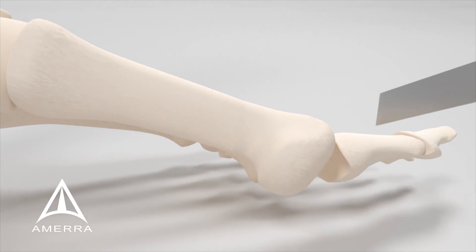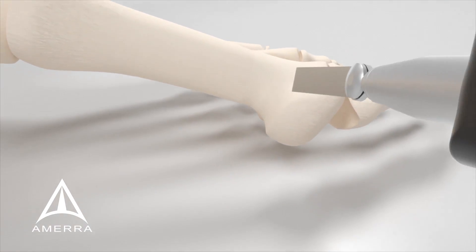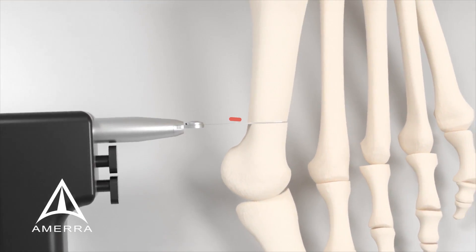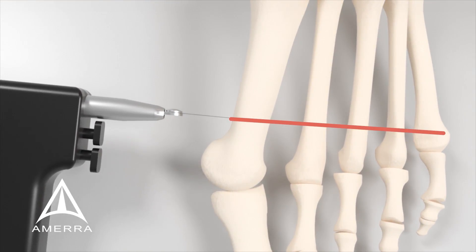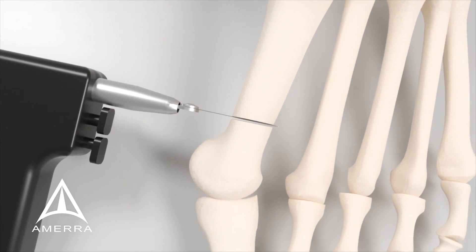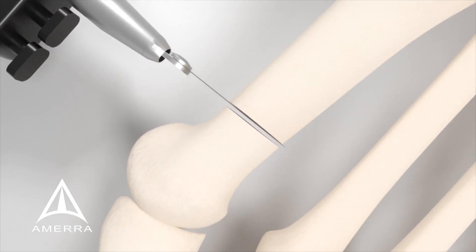Create a transverse osteotomy through the metatarsal using a saw. Angle the osteotomy toward the fifth metatarsal head while splitting the difference of the perpendicular plane to the long axis of the metatarsal and perpendicular to the weight-bearing surface.